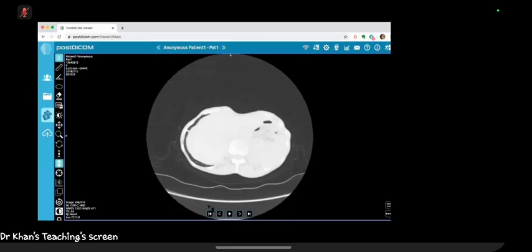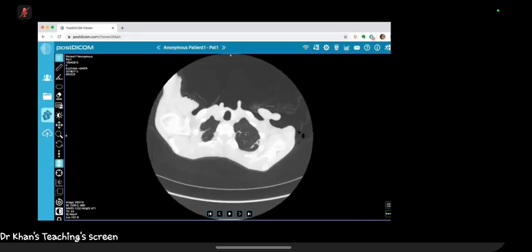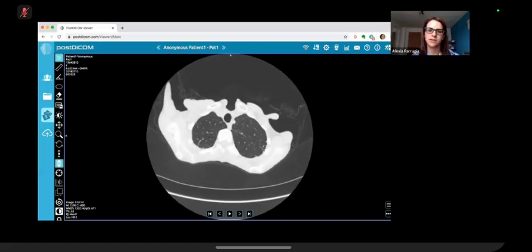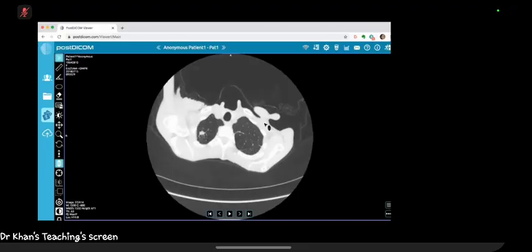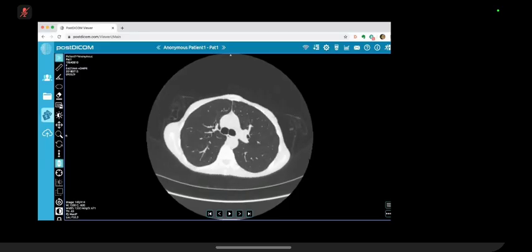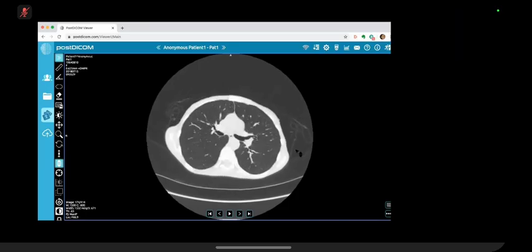Okay. Have you seen an abnormality in the lungs? Yes. I saw abnormality predominantly. To start off with, it looks like there's a mass in the right apex of the lung. Let's go back to that. Here, yeah, right there. So that looks like a concerning spiculated mass, and I'd be concerned about a malignancy in that area. There's no adjacent bony involvement. And going down to the middle lobe, there's also a nodule. There are several nodules in multiple lobes.